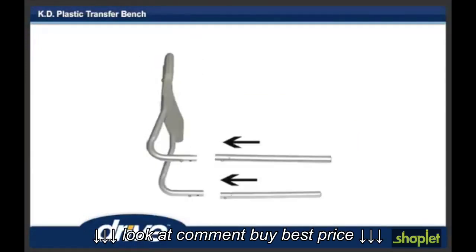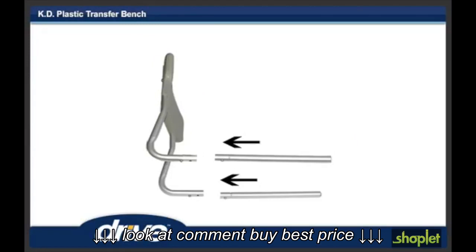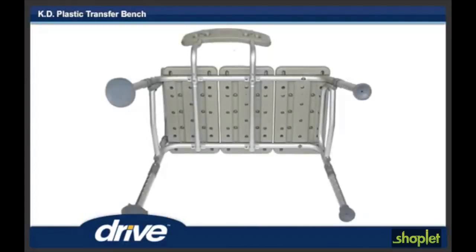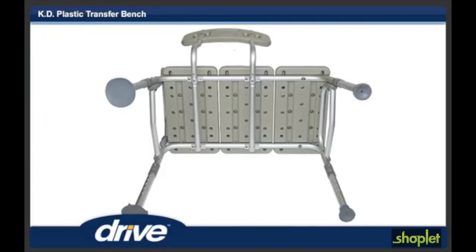Step 6. To assemble backrest, insert backrest tube into backrest support by depressing pushpin and sliding into receptacle. Repeat for second post. Insert backrest into base by depressing pushpins and sliding supports through both receptacles.